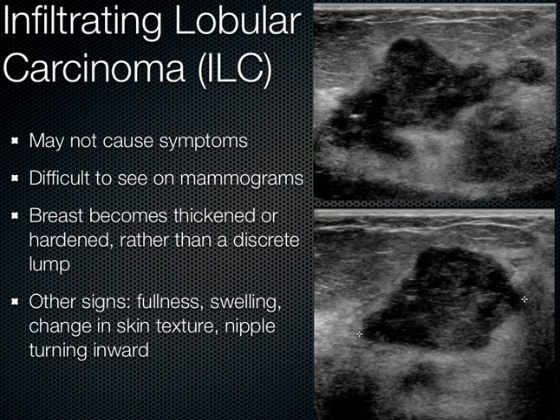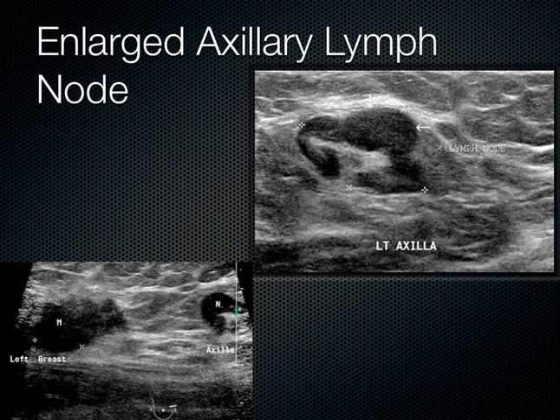It has a tendency to become really more multifocal, so you can see this in different areas of focality, and with really the same prognosis as that of a ductal carcinoma. And this ultrasound image here is of the left axilla in a patient basically who's got this hypoechoic group of lymph nodes, and the metastasis is seen here.